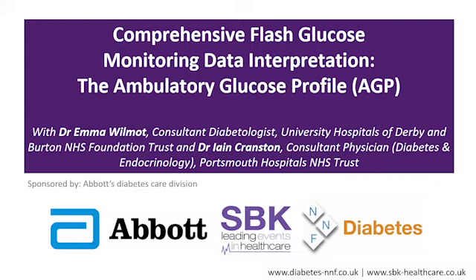So I think the key from that perspective is developing a structure that allows you to get through to the nitty gritty, as it were, relatively quickly. For me, it is about numbers, AGP, individual data. A lot of people, particularly when new to looking at CGM data, will start from individual days. You could spend all day looking at one profile if you're starting with the individual days. And equally, you end up giving contradictory advice from one day to the next.